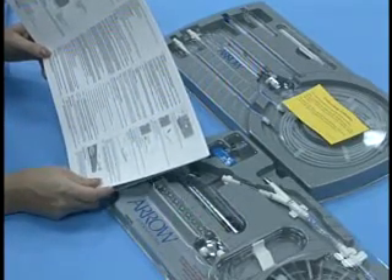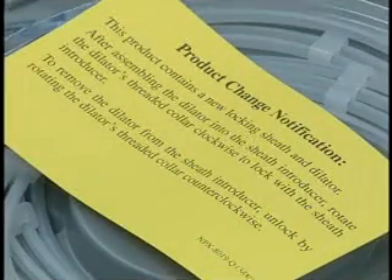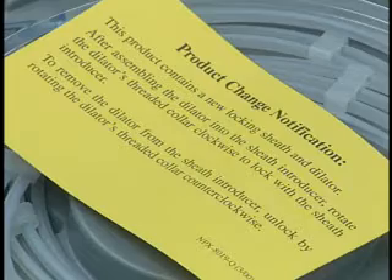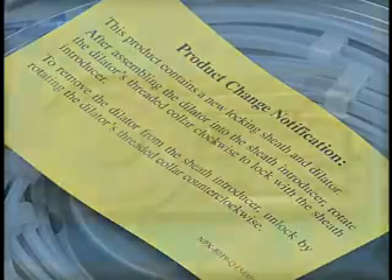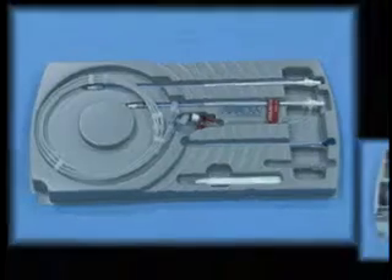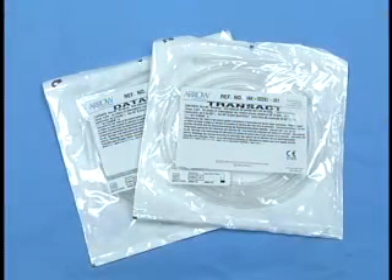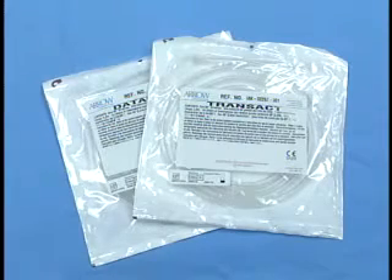New changes to the product are identified by the addition of a yellow card in the IAB package, which details the specific product change. The balloon packaging includes a separately packaged insertion kit and intra-aortic balloon catheter. Driveline tubing to connect Arrow intra-aortic balloon catheters to other manufacturers' balloon pump consoles is provided in separate sterile pouches.